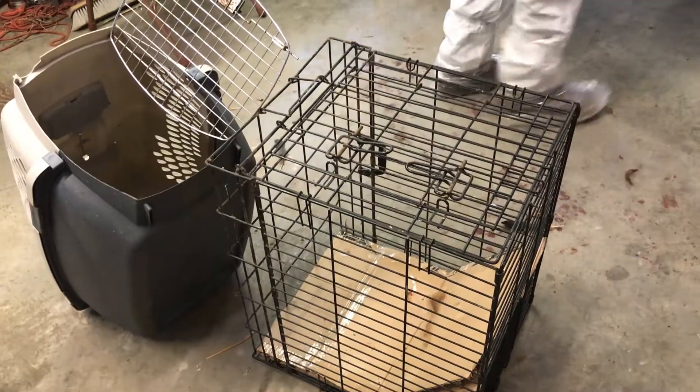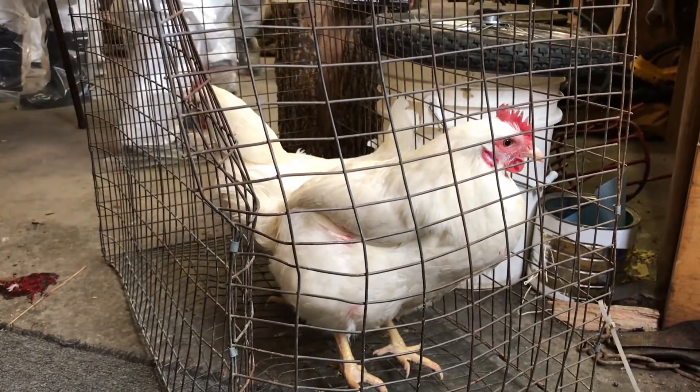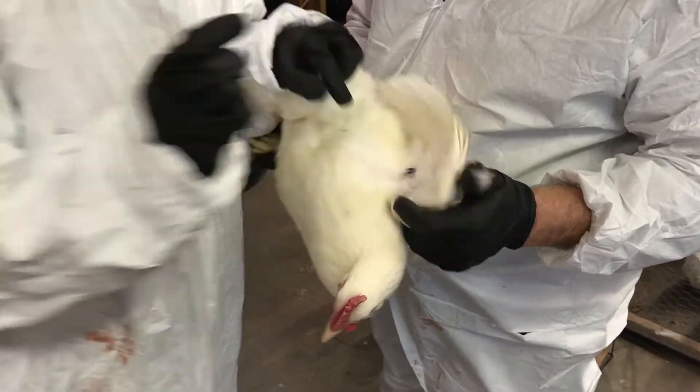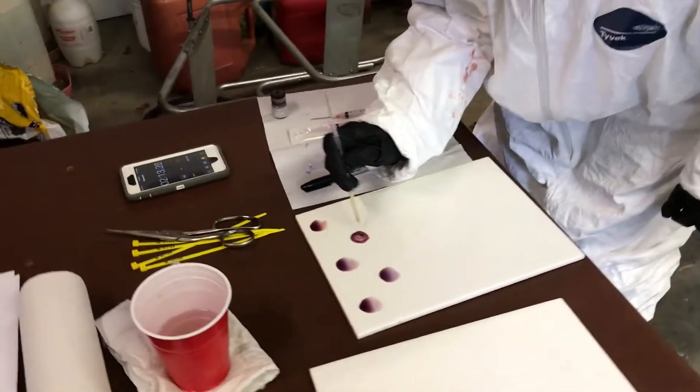Cages or some other holding areas should be available for the birds being tested until test results are read. It is also a good idea to have an extra hand or two to assist. This will save time and make your job easier.